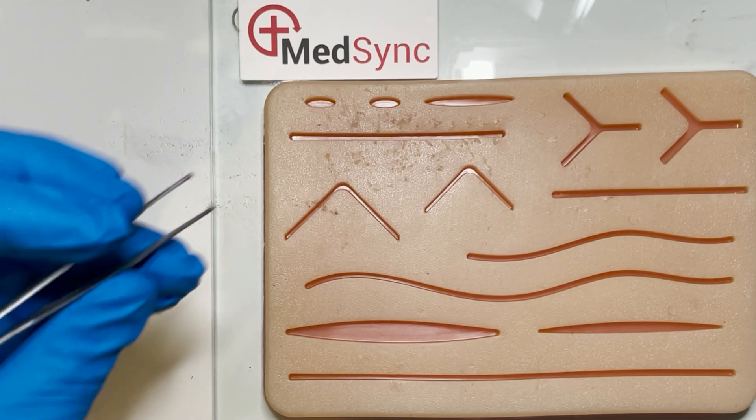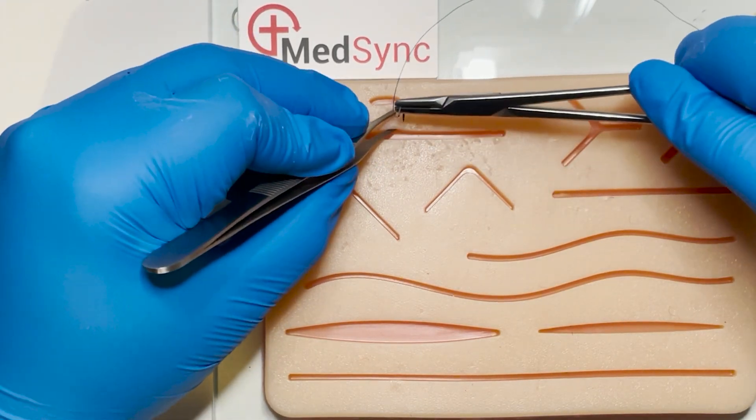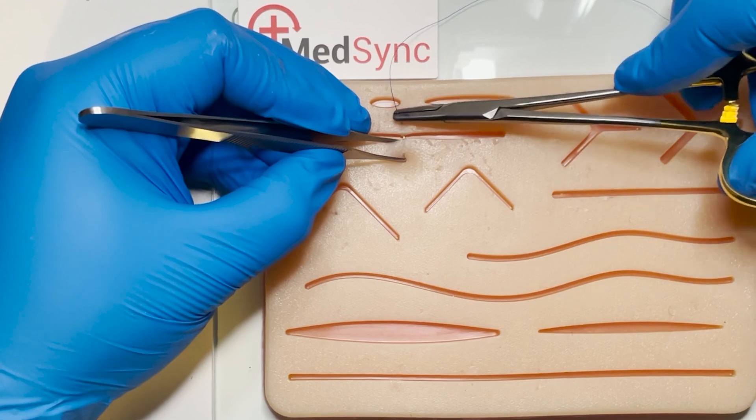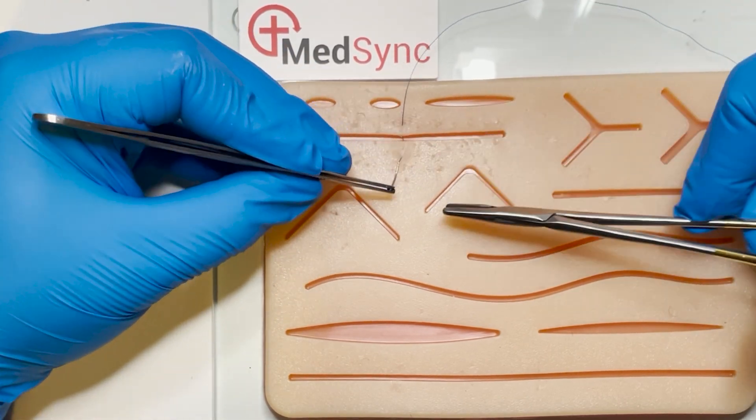Operative pace is often determined by decisiveness and minimizing maneuvers that have no intention. Reversing your suture needle is one of those maneuvers that commonly gives rise to overhandling.